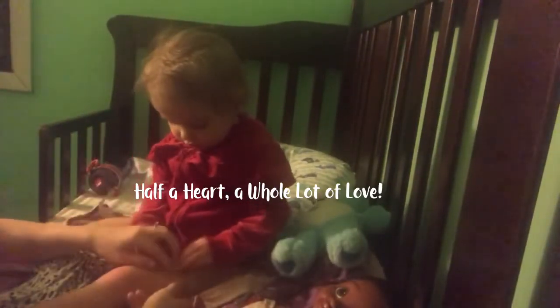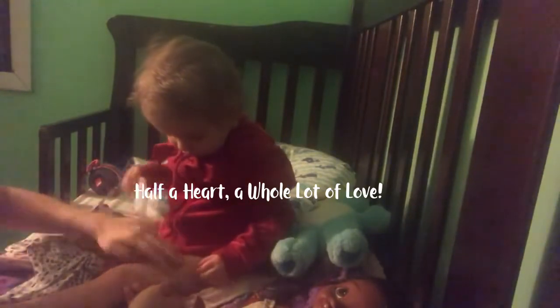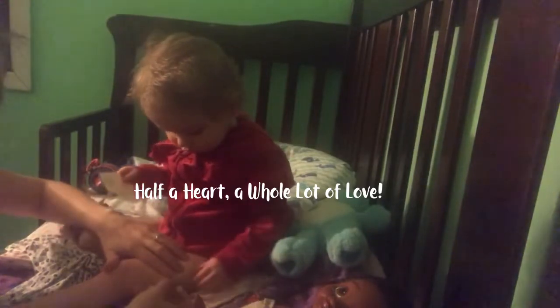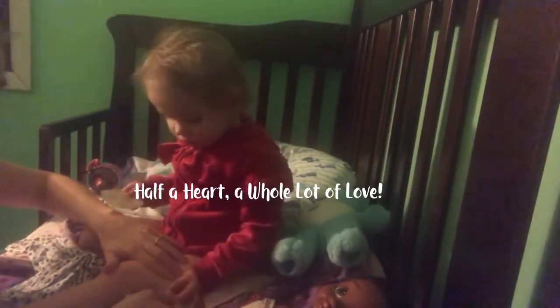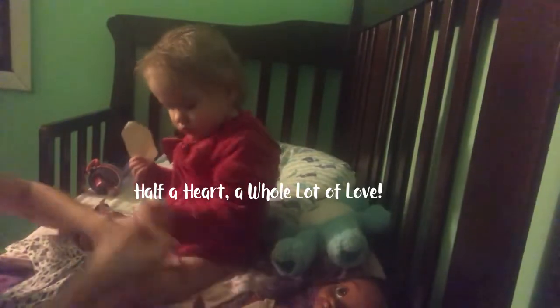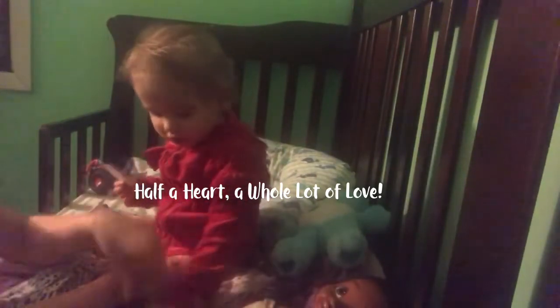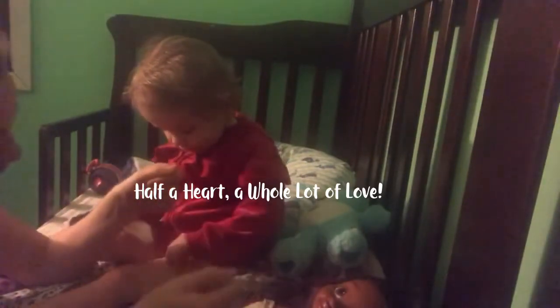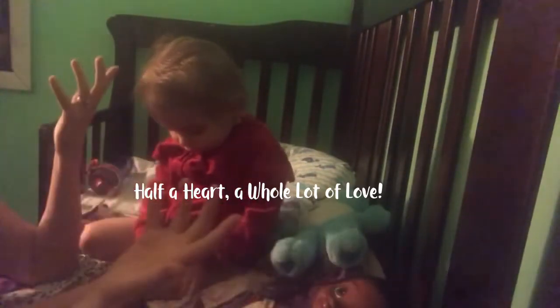Okay, ready, babe? I'm going to show everybody how to do it. So what we're going to do is I put my finger right here, and then I tug. Can you see? I'm pulling with the skin, so I'm not pulling it up. And there she goes. So that's the idea. It stretches, so you want to stretch it out. As it's stretching, it actually just comes right off of the skin.